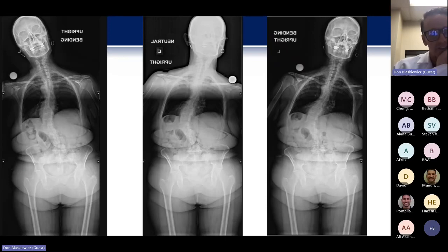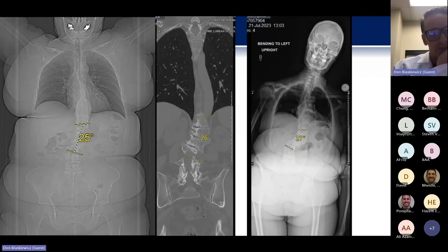With these patients, I had bending pictures, and you can see with her lateral bending, this is a pretty rigid segment. Also on CT, those segments were rigid but non-ankylosed. And you can see she had the bridging osteophytes here. And for me, I still like to do the releases on those.